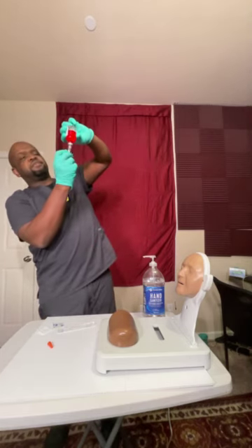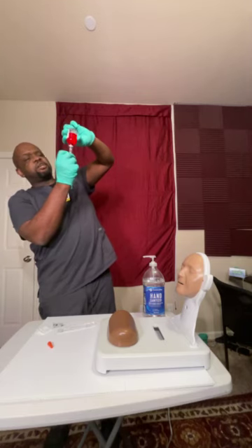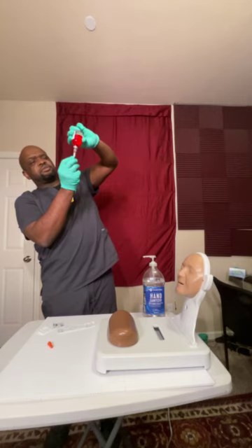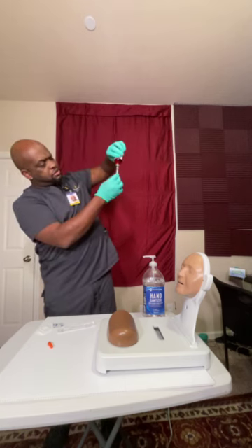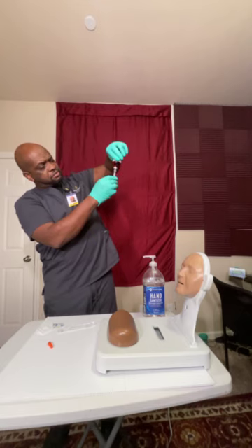Now I'm going to leave the syringe inside the bottle and tap the bottle because I want to make sure there's no air inside the bottle. Right? So 0.1. Let's make sure that's there. Okay, making sure that's right on 0.1. Good.